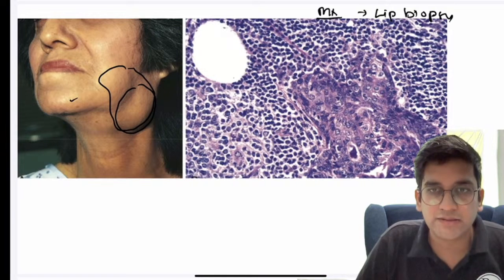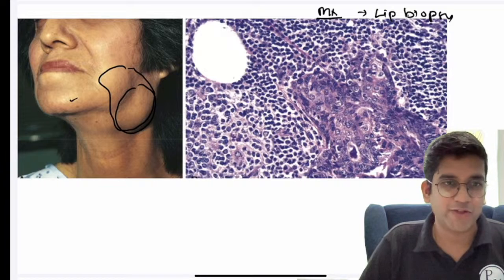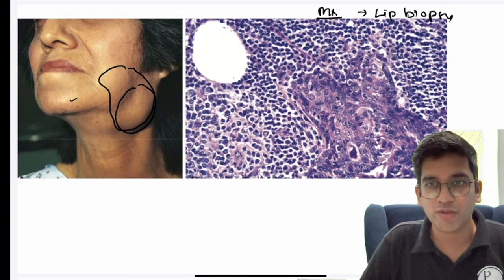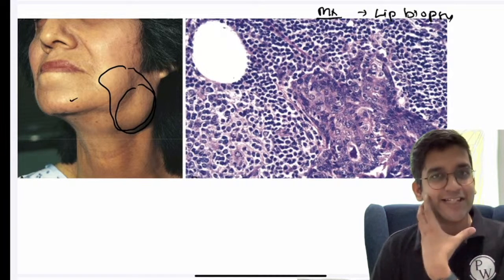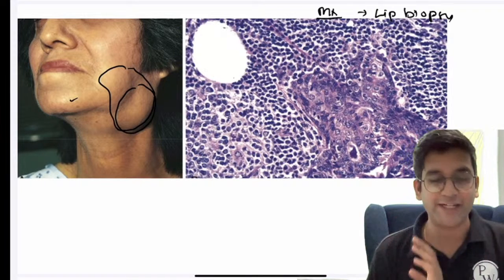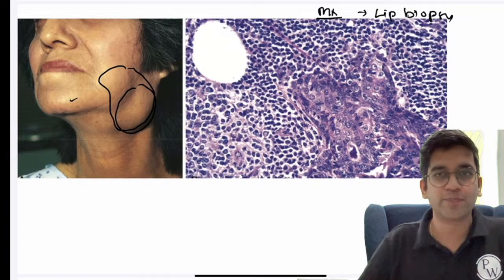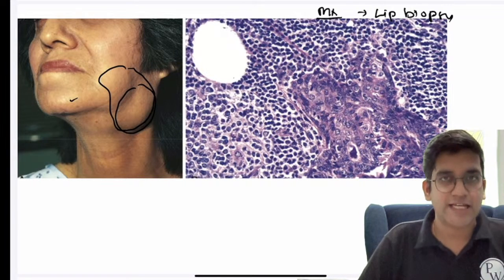Okay, and Das has gone with pleomorphic adenoma. Pleomorphic adenoma. Okay. I'll give you one more clue. Yes, clinically it's right to call it pleomorphic adenoma, but on microscopy I don't have cartilage, so I don't think of an adenoma. This patient also had dry eyes. Can anyone tell me the answer? Dry eyes, salivary gland swelling, and microscopy has these structures.